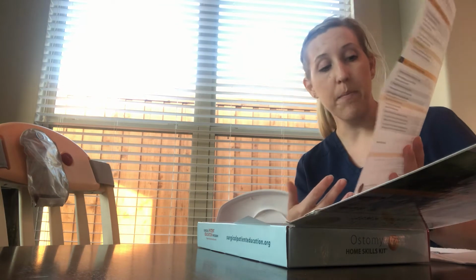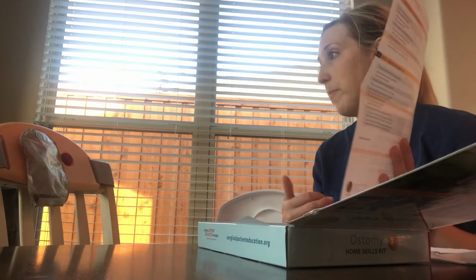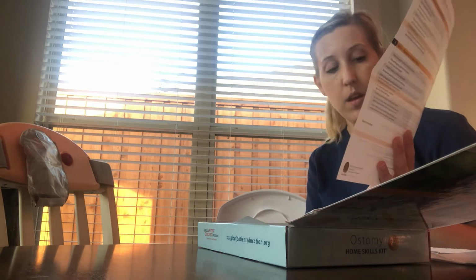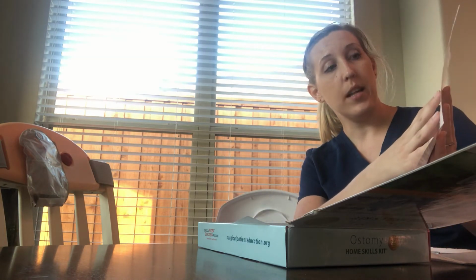We don't reuse them. And then also for cleaning and inspecting the skin, every single time you change your ostomy bag, you're going to want to clean the skin and then inspect it to make sure that there's no skin breakdown. And then pat the skin dry, cleaning it with warm, soapy water prior to that. And then if you go to the back, it has how to measure and cut the opening.